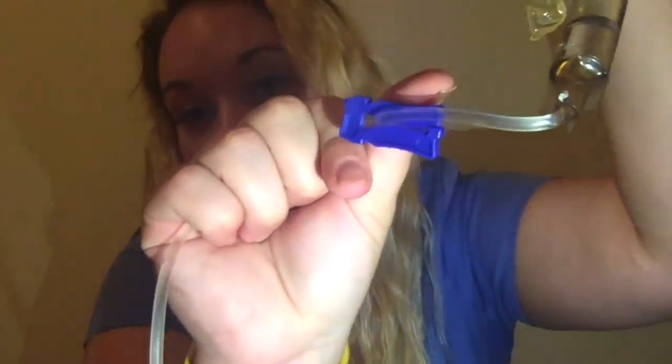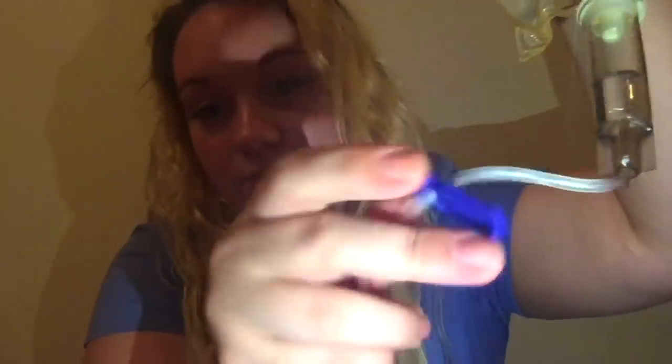Then you can clamp it right here — push that so it is clamped. When it's not clamped, the fluids are running. If you push it this way, the fluids can't run because it's clamped.